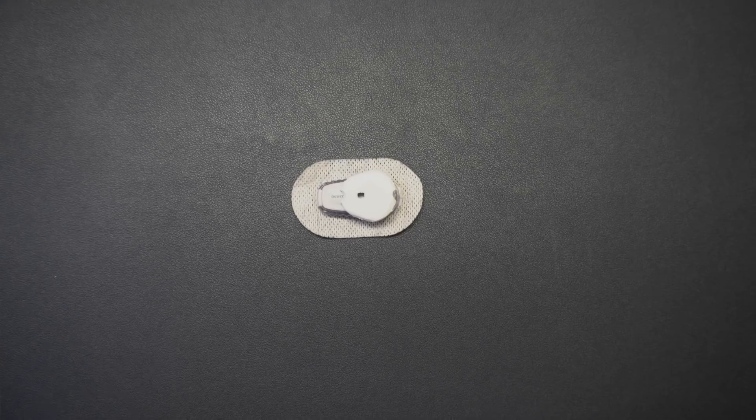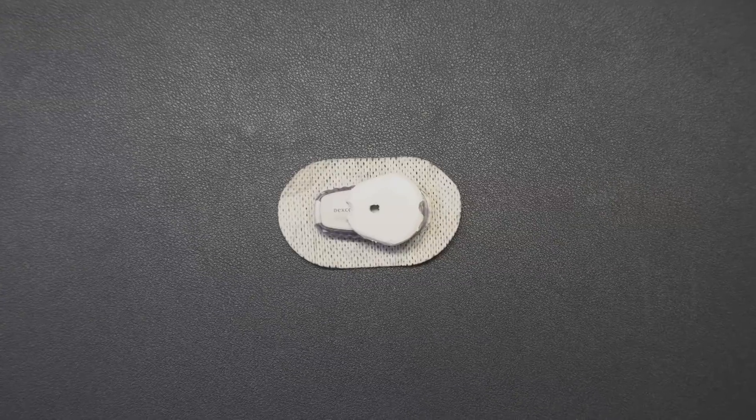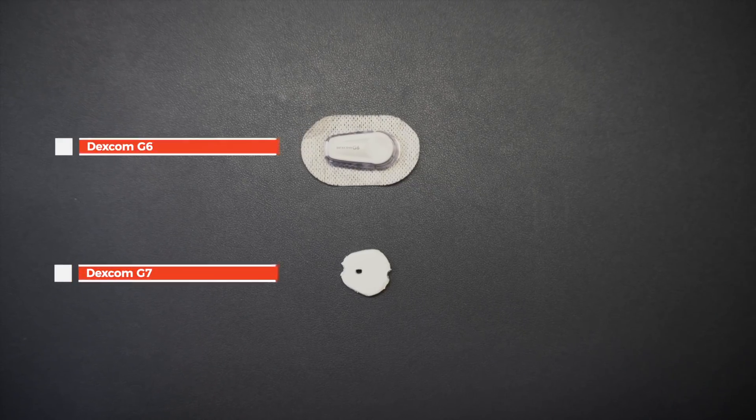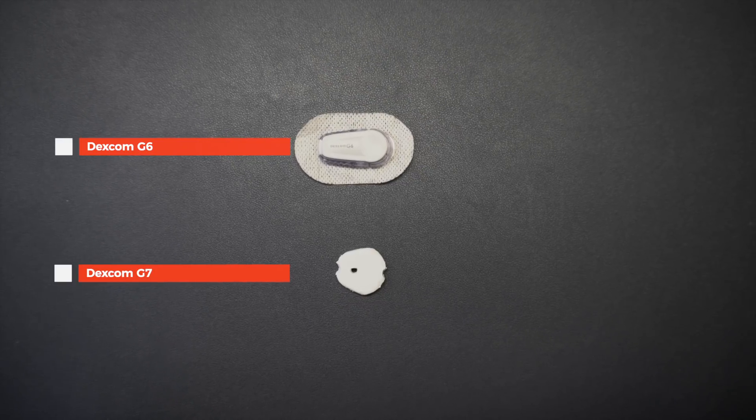Beyond this, Dexcom G7 will be 60% smaller compared to Dexcom G6. I've built a mock-up just to give you a rough idea of how much smaller Dexcom G7 is compared to G6. This is not hugely precise, but just to give you some flavor of just how much smaller G7 is when compared to the G6.